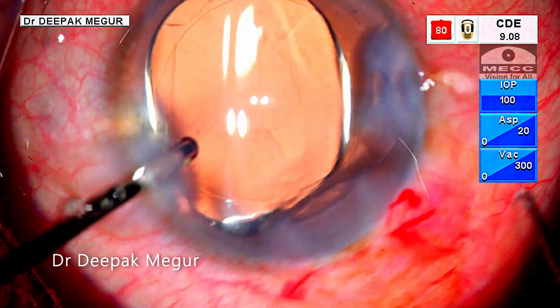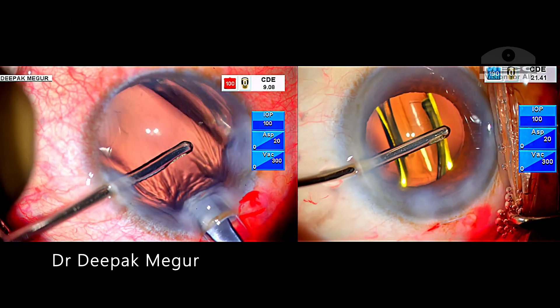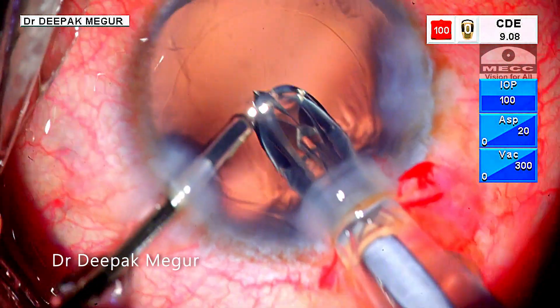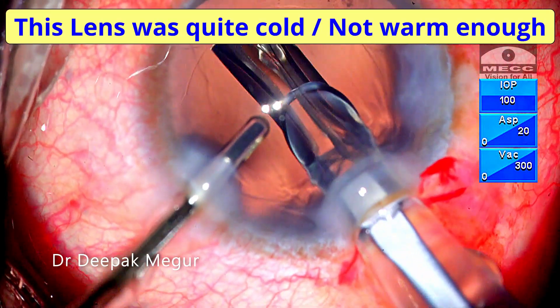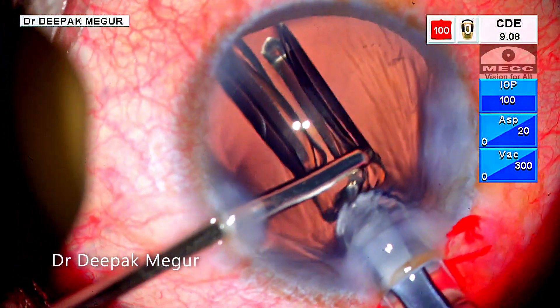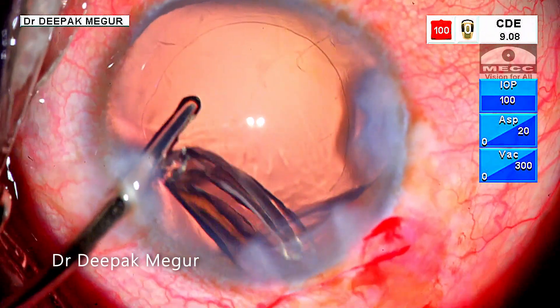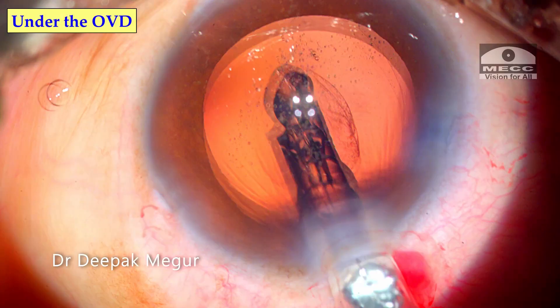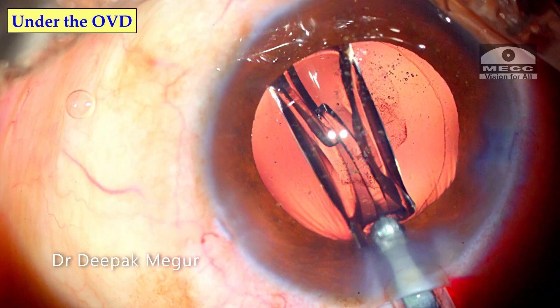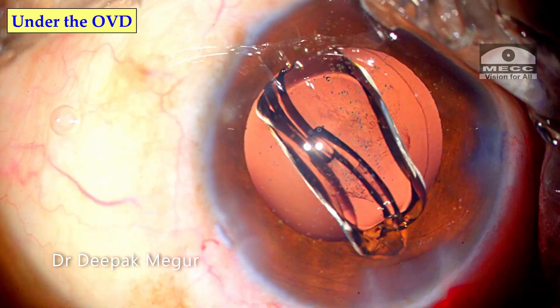Let us try to understand why this lens behaved differently compared to the previous ones in spite of using a similar technique. My hypothesis is that this lens was quite cold, or rather not warm enough. Hence, the stiff lens does not open up and behaves like a single mass, and the fluid current takes it along. A cold, stiff lens would not move around when injected under OVD because of the viscous, jelly-like nature of the OVD, which keeps the lens in place.